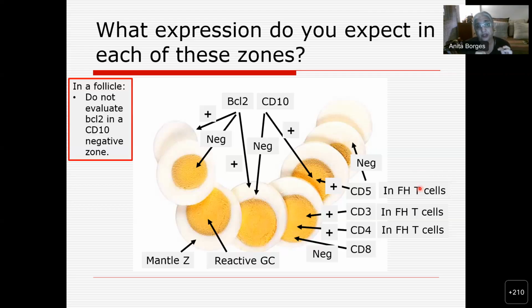You can get a follicle composed entirely of mantle cells, and those are known as primary follicles. There is no stimulation of a germinal center, which happens when there is an antigen to which this B cell follicle responds. It has CD23, it has the mantle cells, because a follicle cannot form unless you have the follicular dendritic cells, okay? They help the B cell areas to actually form follicles, okay?